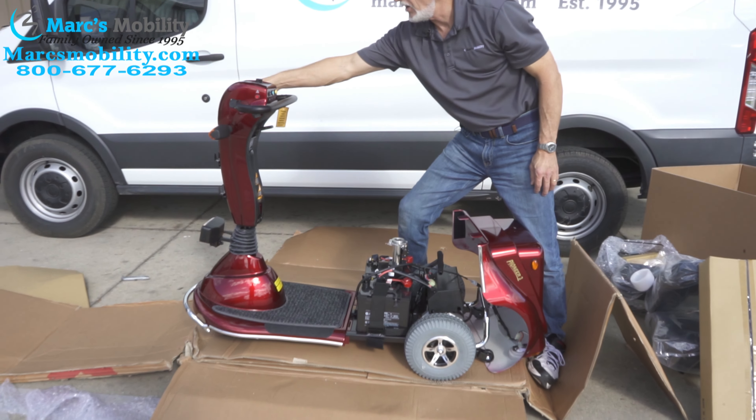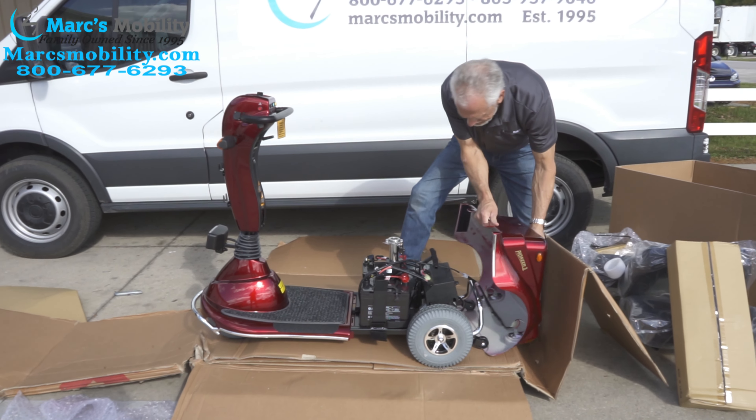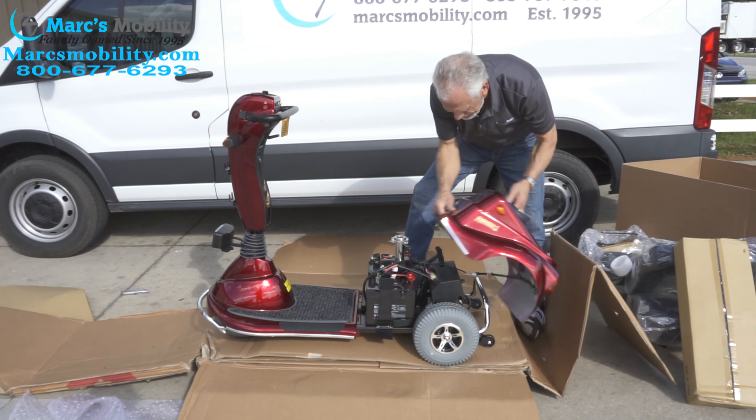I'm going to turn the key off and put the cover back on. When you put the cover back on, it's a little tricky because it's got a lot of Velcro — get the front in first, then push it in. Now, how do we get the scooter off this pallet? I'm going to bring the tiller down and release it. There's a lever back here — it's in neutral now. By releasing that lever and removing this little piece of plastic, I can roll the scooter off. Then put it back in gear. When you turn the key on and move the lever forward, you can see the scooter moving on its own backward and forward.